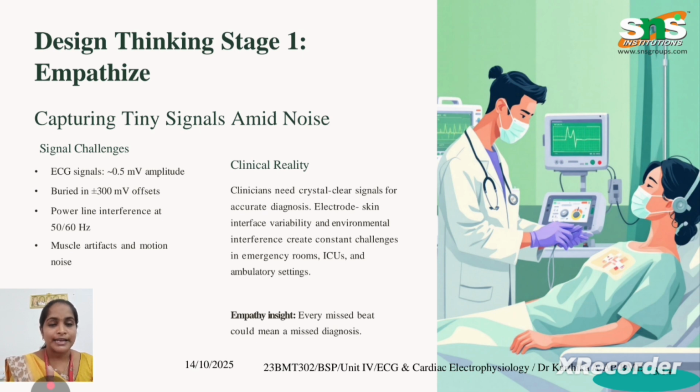And the next one is our clinical reality. Here the clinicians need crystal clear signals for accurate diagnosis, despite electrode skin interface variability and environmental interference. It should be clearly stated in our device. And here our empathy insight is: every missed beat could mean a missed diagnosis.